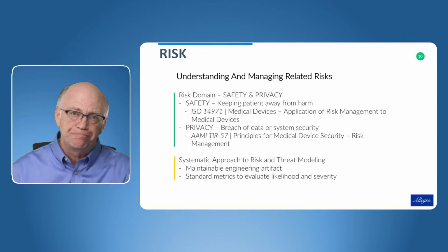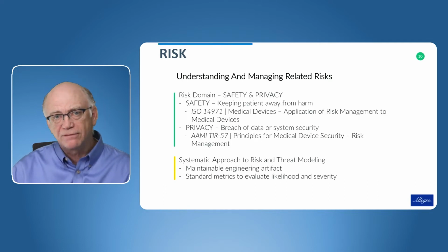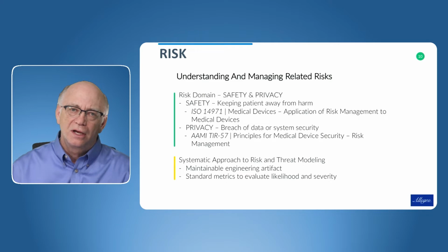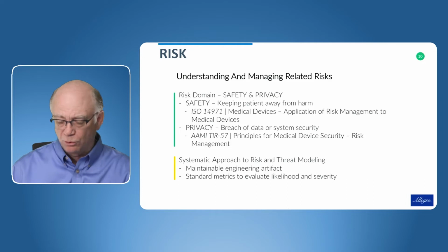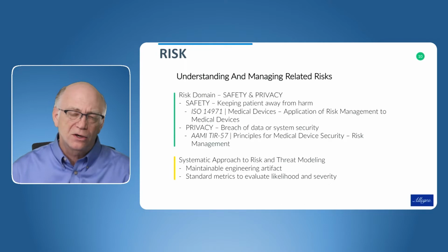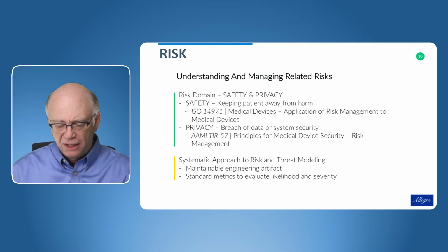There's a number of overall guidelines that are provided here as well. What's most important is that there's a systematic approach, and again, every device manufacturer approaches this in a different way, and they all have a different systematic approach for relating to and mitigating these particular risks. The main thing here is that you provide maintainable engineering artifacts that come out of these processes, and that gives you a number of metrics that you can evaluate for the likelihood and the severity of a potential threat to your device.